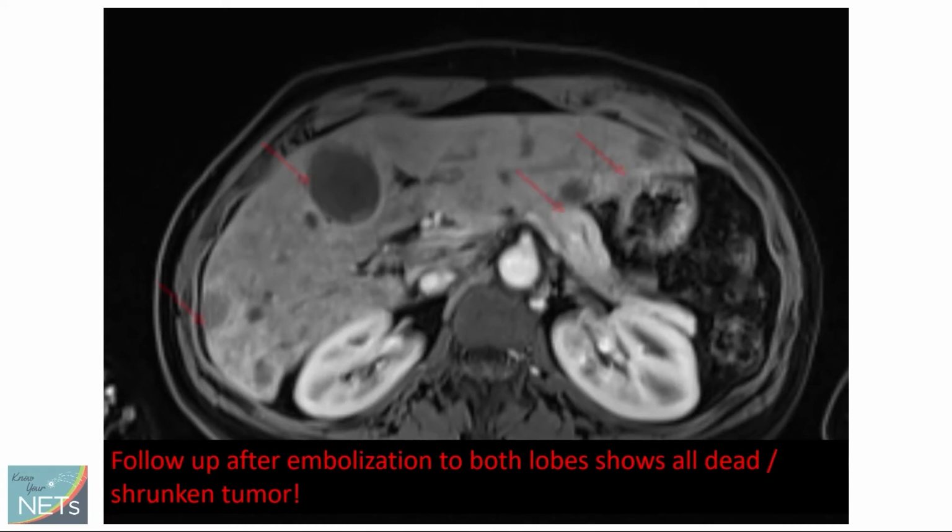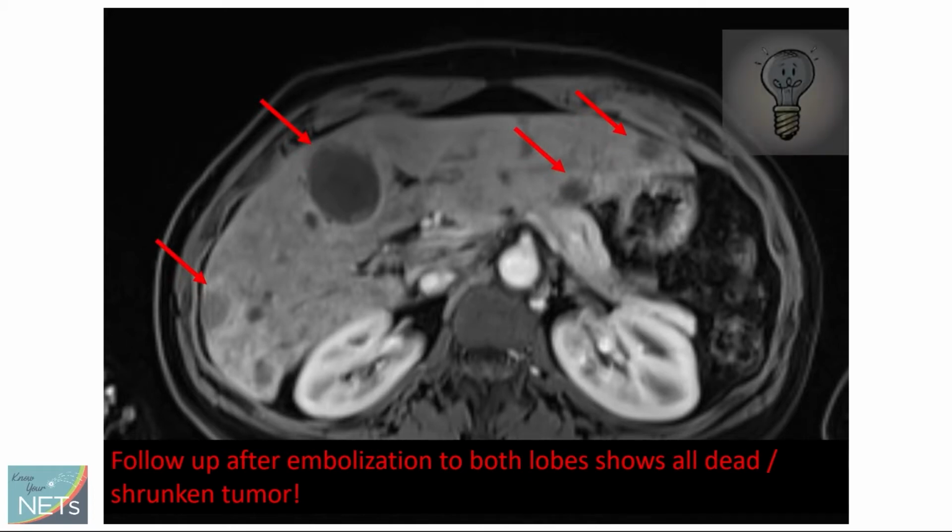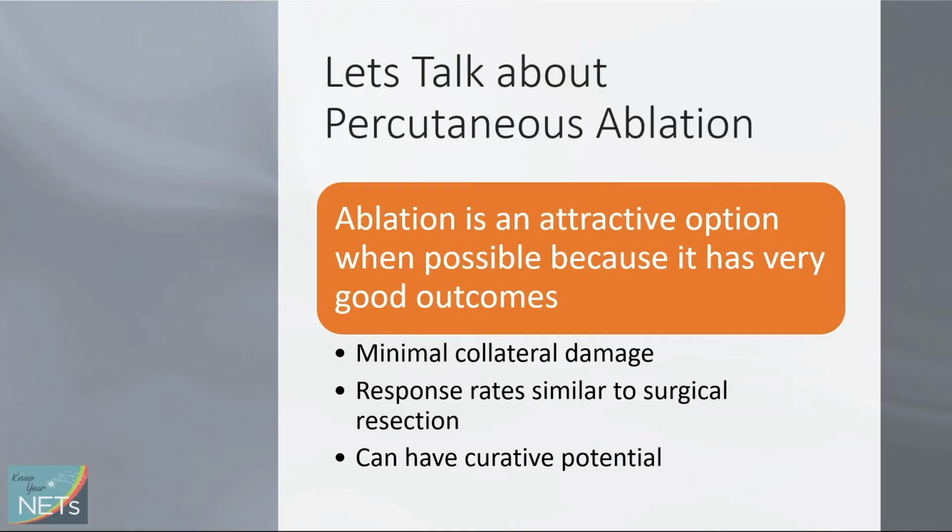This shows that there's all dead, shrunken tumor. So again, the light bulb has been burnt out. There's no more tumor that's active here. So this is a really, really nice result.